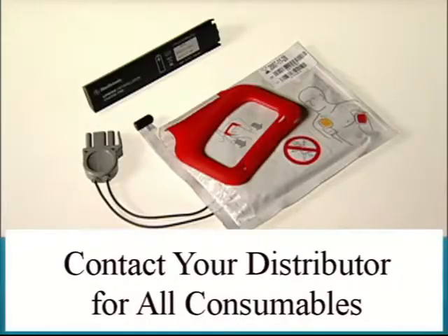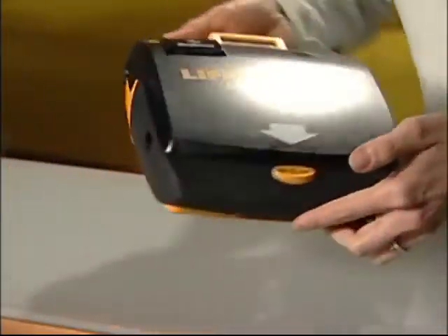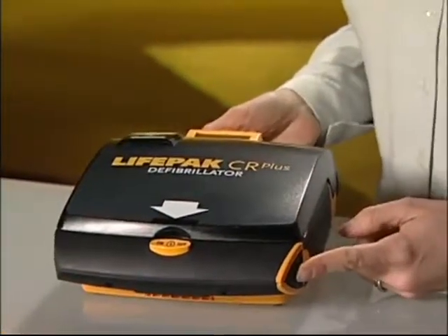If you ever do have to use the AED, there are a few steps you need to take so it's ready in case you ever have to use it again. Be sure to refer to the user manual for a complete description. You'll also find information there about how to replace the electrode pads and the battery charge pack when they pass their use-by date. The charge pack goes right here.